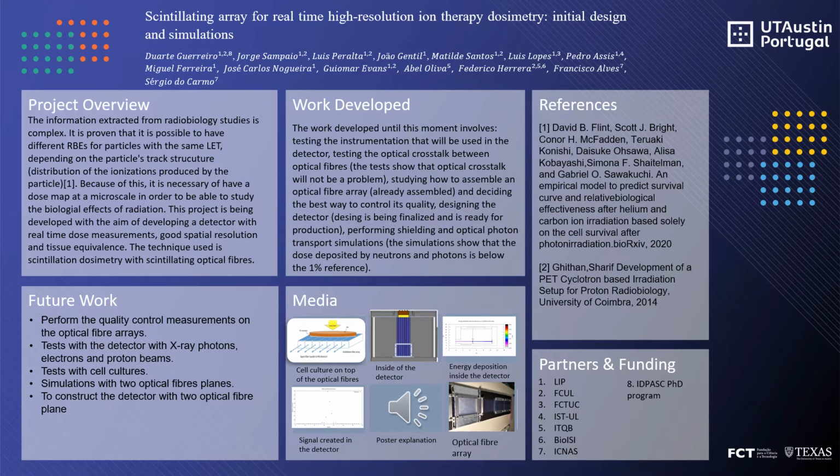I will be talking about a project developed with the participation of several research units in Portugal. With this project, we have the objective of developing a detector to enable the radiobiology professionals to perform their measurements with good spatial resolution and real-time dose measurements.